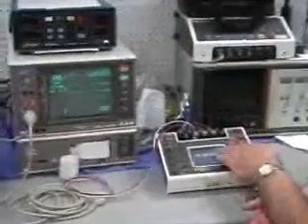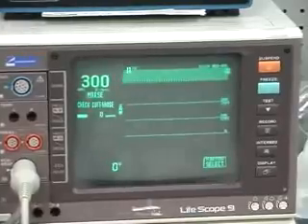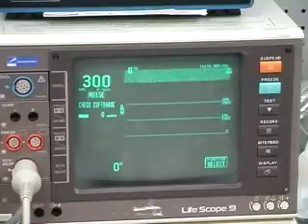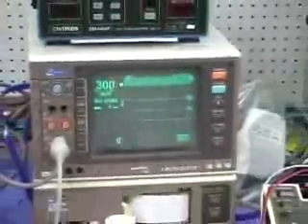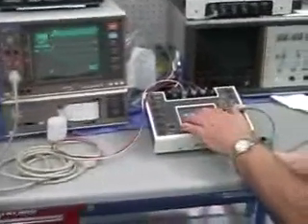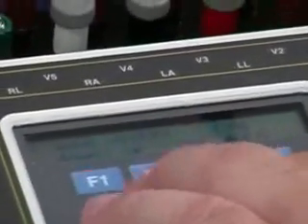But again, at the bandpass, most of the information in the ECG is from about 1 hertz up to about 40 hertz. And then sometimes they will look at higher frequencies, but that's the majority of your waveform content. Okay. This test is set up so that if they say they're having a problem with the heart rate meter being able to pick up a certain ECG, you can run this and verify the operation of it.